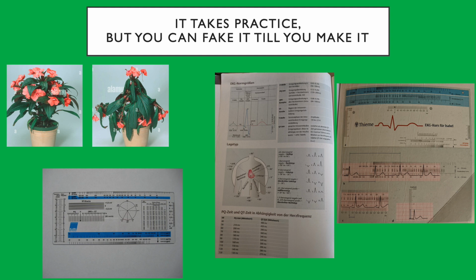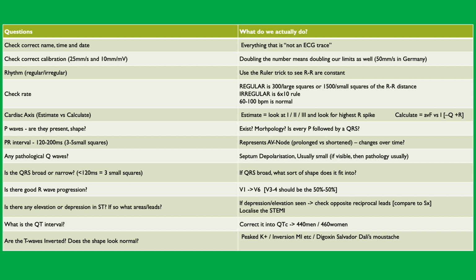So these are the steps. Basically, this is the process. And if you do it a lot, it's like the doctor's ABC. If you do it enough times, it comes like a reflex. The same thing with ECG. If you do it enough times, then you know how to start and how to continue. And these are the steps of what you should be doing every time you see an ECG.